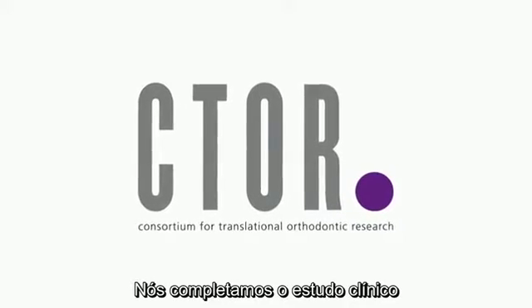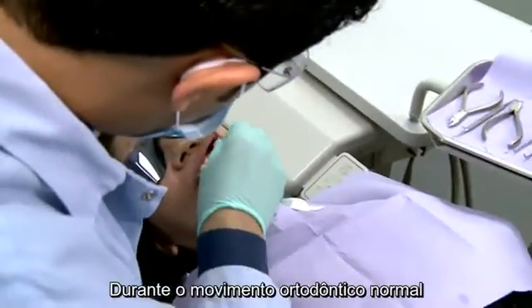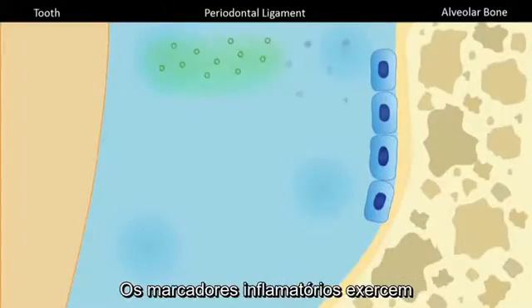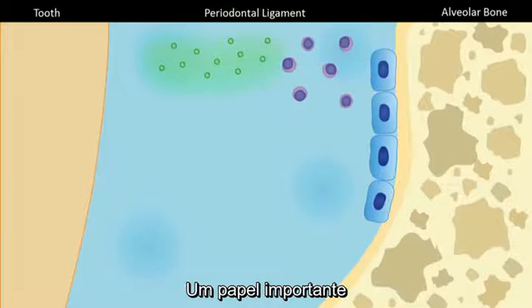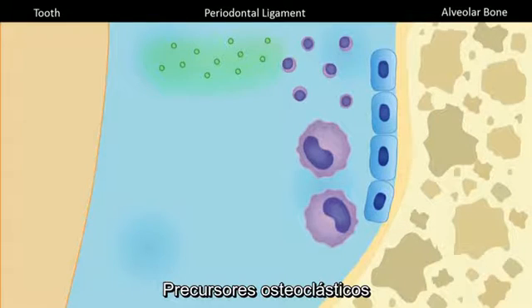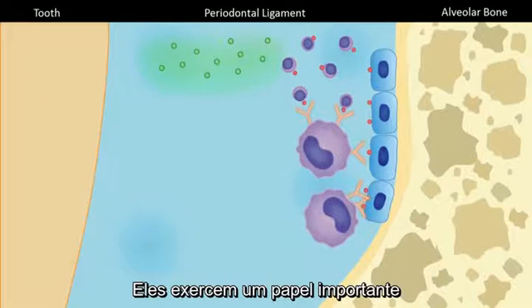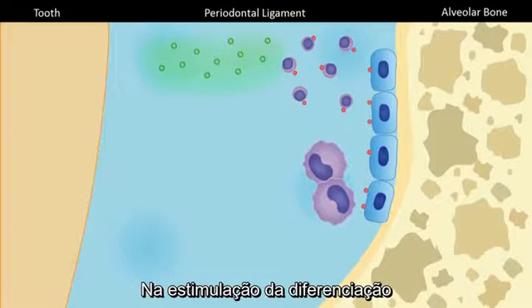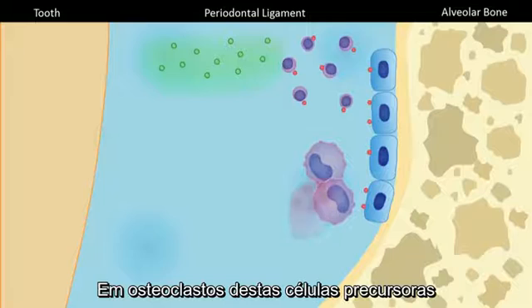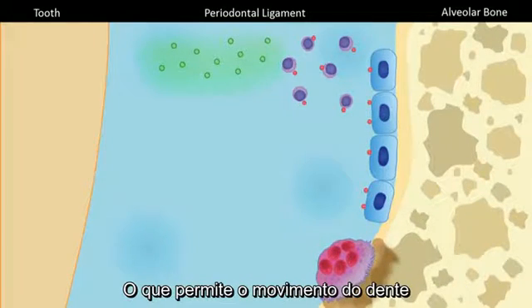We completed a clinical trial investigating the role of micro-osteoperforations in the rate of tooth movement and the expression of inflammatory markers. During normal orthodontic tooth movement, inflammatory markers play an important role in the recruiting of inflammatory cells and osteoclast precursors, and then through the RANK ligand pathway, they play an important role in stimulating the differentiation of osteoclasts from these precursor cells. And then osteoclasts go on to resorb the bone that allows the tooth to move.